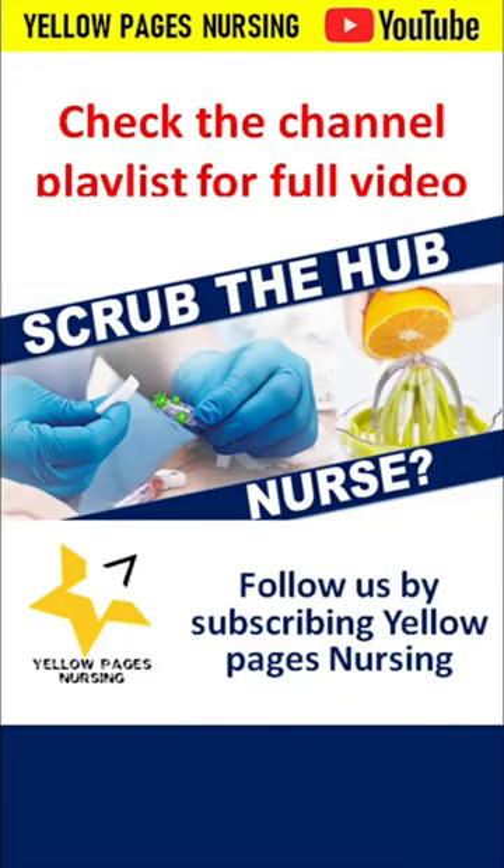For more information about scrub the hub, check the channel playlist for the full video and follow us by subscribing. Yellow Pages Nursing — thank you.